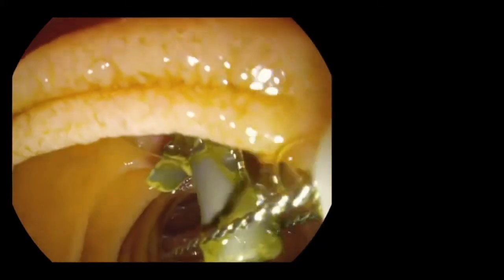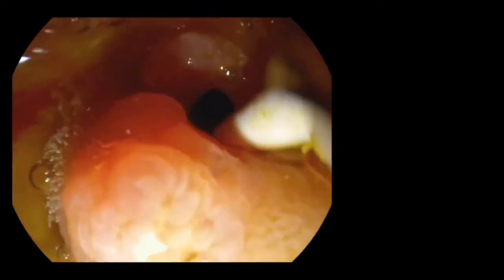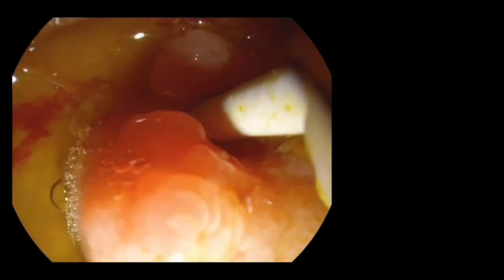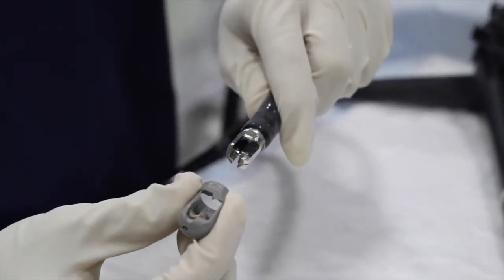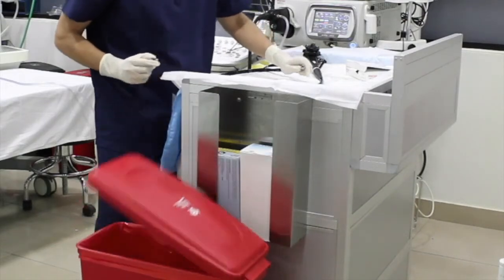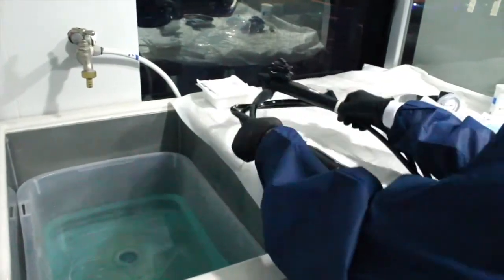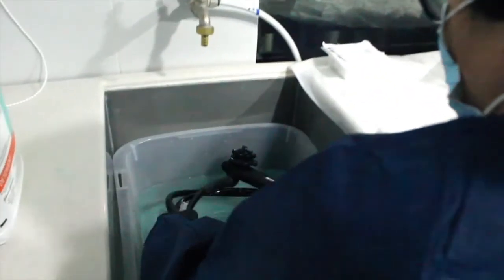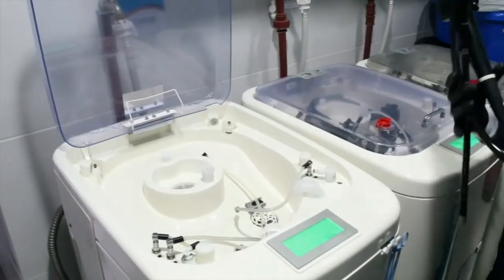The video duodenoscope and the disposable elevator cap allow adequate maneuverability for the proper technique in ERCP procedures and even digital cholangioscopic procedures. After the endoscopic procedure, the disposable cap is retrieved from the duodenoscope tip. Then a standardized pre-clean followed by high-level disinfection and reprocessing protocol of the duodenoscope must be followed before further procedures.